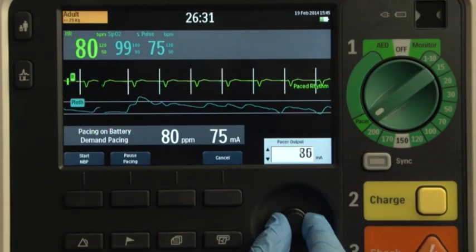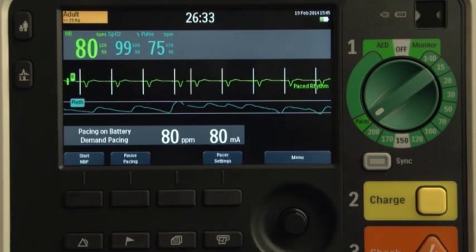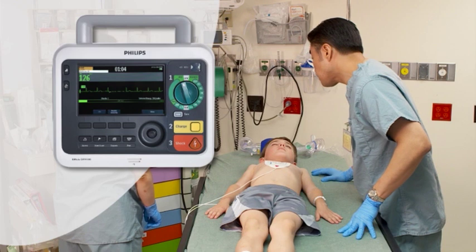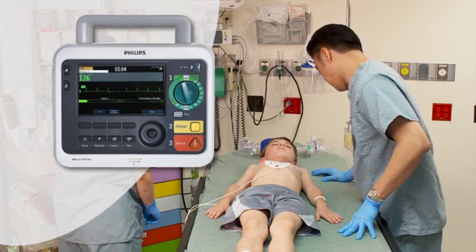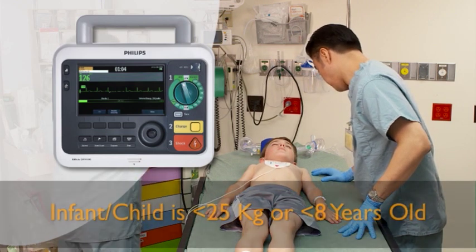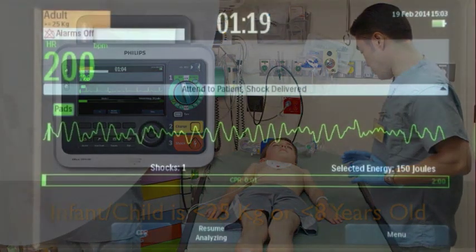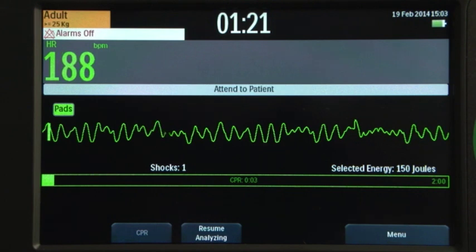The optional pacing mode offers non-invasive transcutaneous pacing therapy. In AED mode, the Officia DFM100 analyzes the infant, child, or adult patient's ECG and determines whether a shock is advised, and guides you through the resuscitation process.